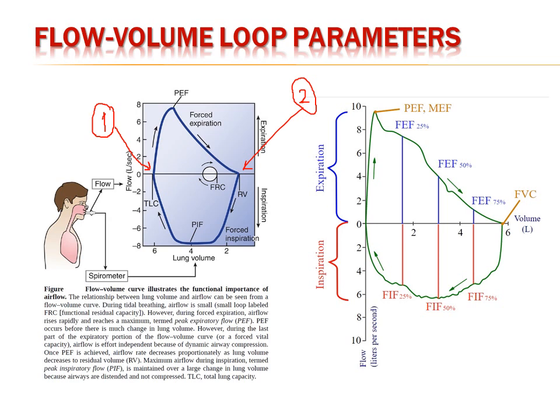There is no peak like in the upper part of the curve. It is much wider. So the maximal, or peak, inspiratory flow is not pointed.